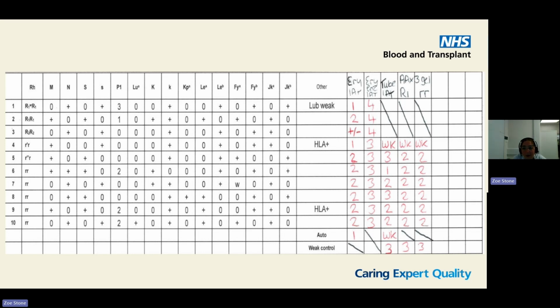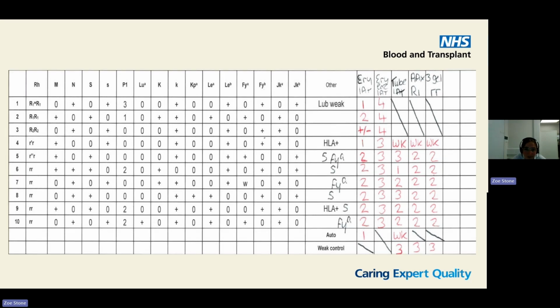So unfortunately, at this point, we ran out of sample. So we had to get a repeat, and we could put some notes on the file for the next sample that we received. And we did do some looking at it, and when we looked at it, yes, that cell was negative for S and Duffy A, and if they did have an anti-S and an anti-Duffy A, that would match the reactivity that we were seeing with those consistent 2+ reactions.